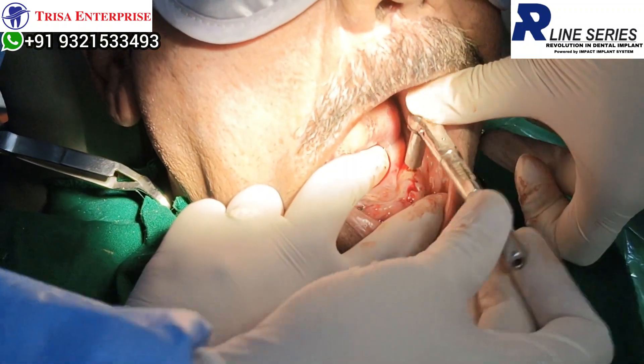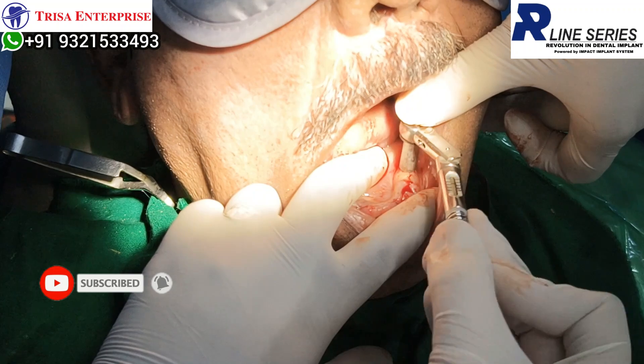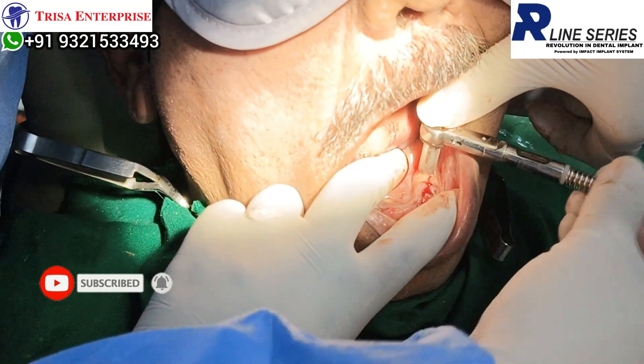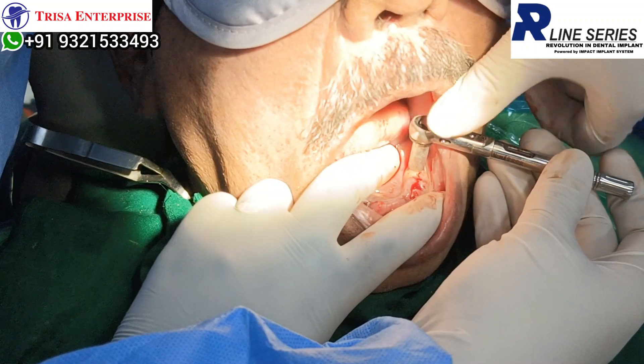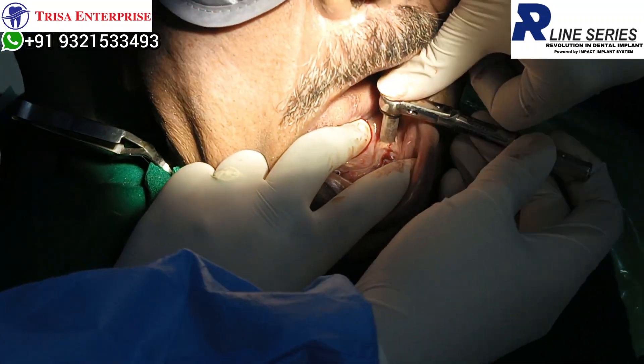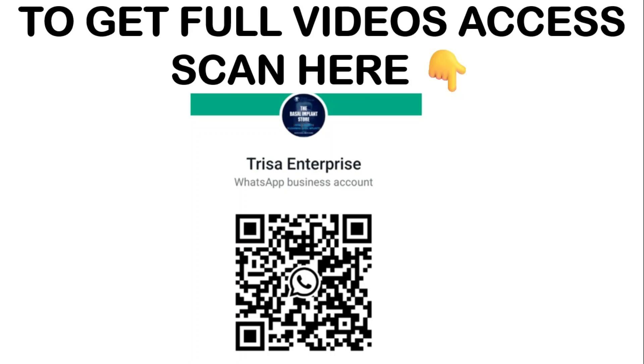Keep the inside towards us. Once the locking starts, what you can do is control from the door.